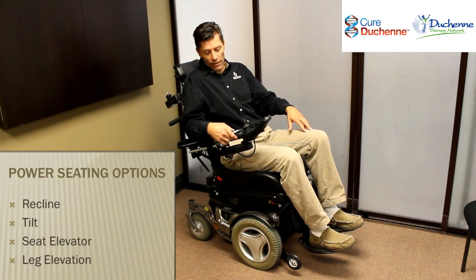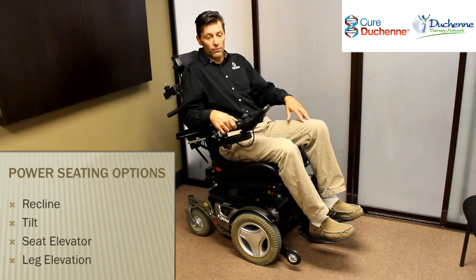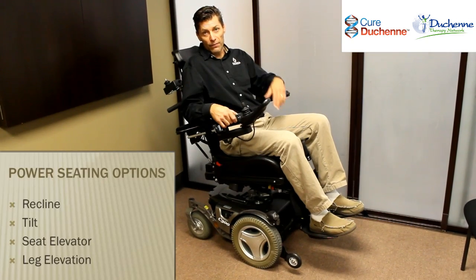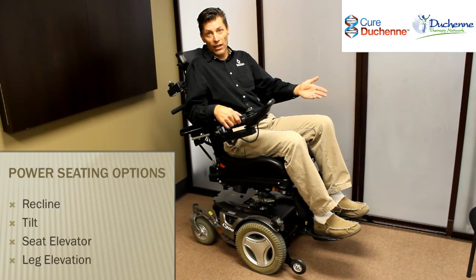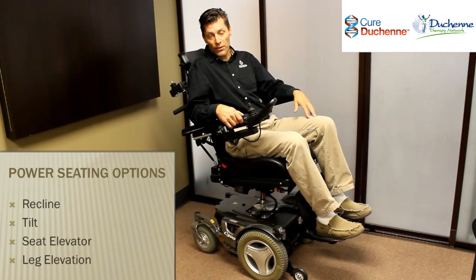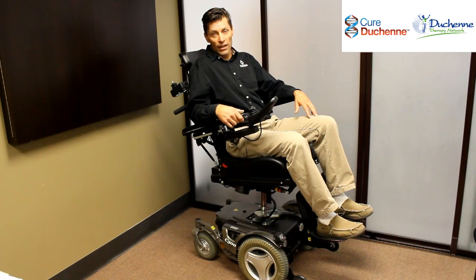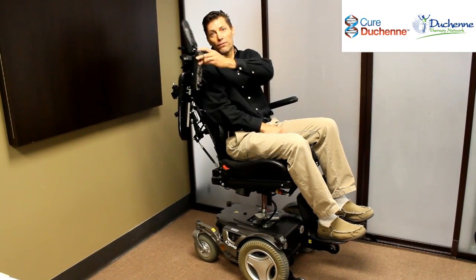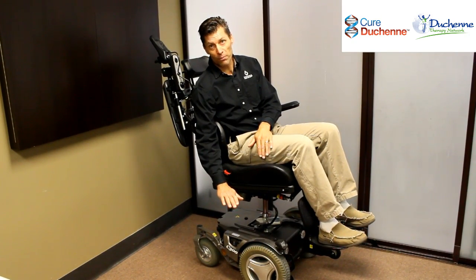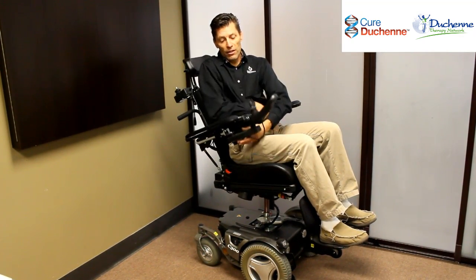And the last feature that we have to take a look at on this chair is a power adjustable seat height. This feature, which is available on every manufacturer's chair, brings the seat up high enough so that it can allow eye-to-eye contact for peer group integration, getting up to surfaces such as countertops, desk heights and others for a variety of activities. And one important feature is that it can allow for a downhill transfer in almost all circumstances. I'm up high enough now that a transfer to a chair or bed is going to be downhill. Then I can lower the seat and be able to transfer back downhill into my chair.